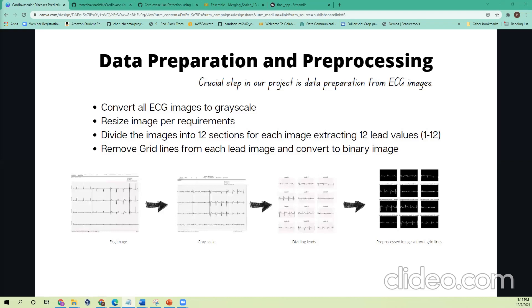Once resizing is done, we find all the divisions of an ECG. We are working on 12-lead ECG images, so there are V1 to V6 leads, and the other leads — lead one, lead two, lead three, AVR, AVL, and AVF. We divide these into 12 leads for our understanding. Once we get the necessary signal out of it, we then remove the grid lines, since grid lines are of no use for processing.